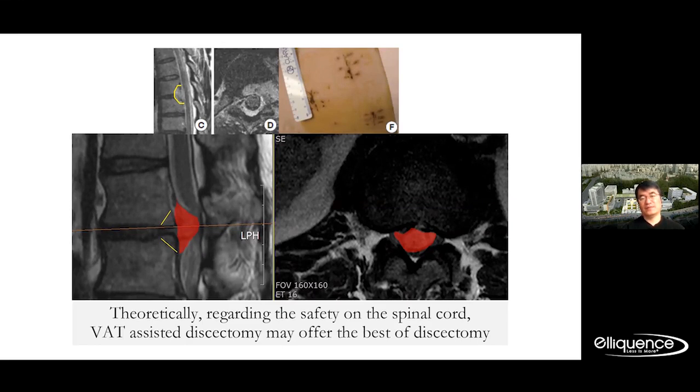But the level is lower, so I'd like to adopt the endoscopic procedure for this patient, because with thoracotomy and thoracoscopic surgery, in most cases, we cannot exclude the morbidity and complications related to the surgical approach.